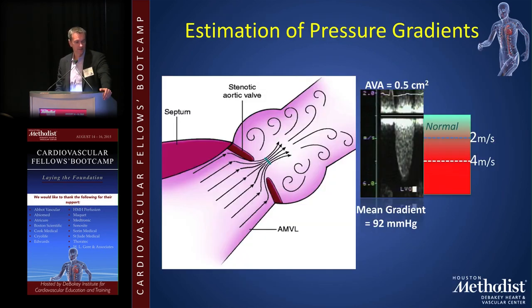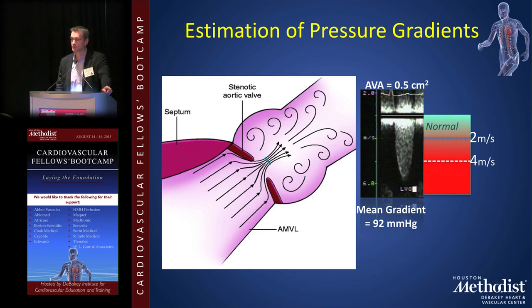This shows the LVOT, a stenotic aortic valve, and the vena contracta — the narrowest portion — with accelerated velocity distal to the orifice. As a general rule on echo, any velocity over 2 m/s — with the exception of mitral regurgitation — needs attention. Pulmonic stenosis, tricuspid regurgitation, mitral inflow: if you see a velocity over 2 m/s, pay attention and determine if it's normal. In this aortic stenosis example, velocity is about 5 m/s. For reference: 2 m/s is normal, 4 m/s is severe, over 4 m/s is more severe.